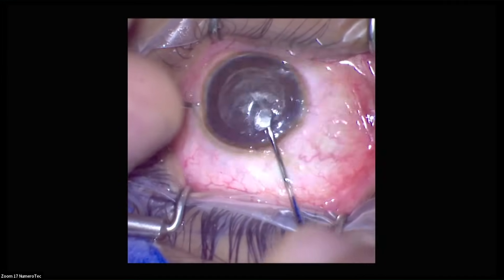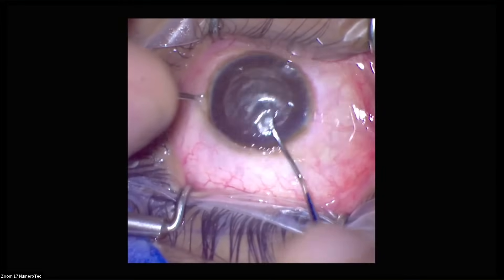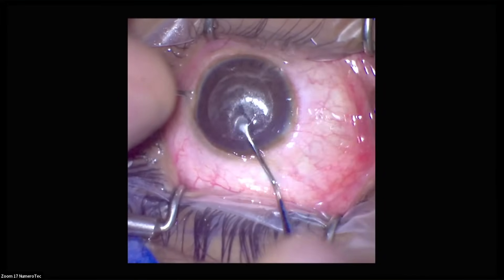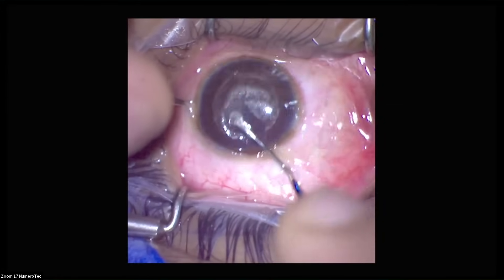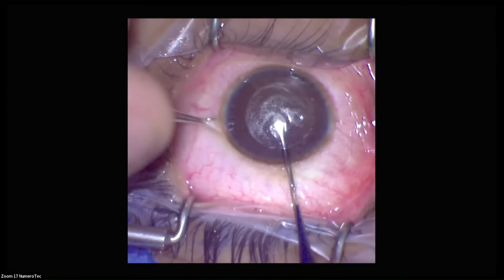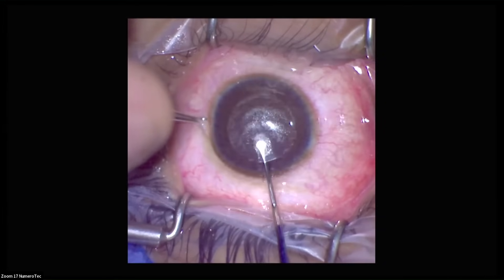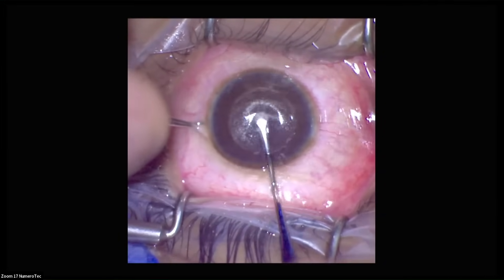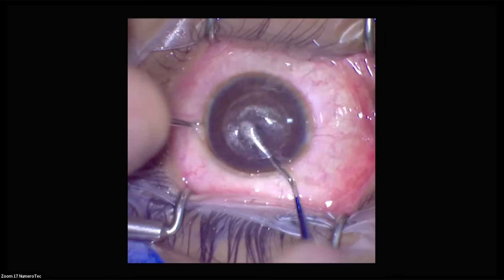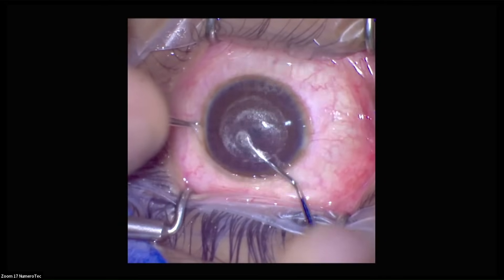Lift up on the cap when entering the superior pocket so we don't enter posteriorly. Then just move like a windshield wiper. You'll find that sometimes the left eye is a little trickier because the dissection instruments come in contact with the speculum, so you just have to find your way to maneuver around it. Dissecting till the edge — that's the superior dissection done. Now entering inferiorly; once you've entered inferiorly, extend that incision to the edge. Now for the posterior dissection, I'm only going and dissecting the center of the lenticule — not cutting the edge yet, going as close to the edge as I dare but not quite touching it.